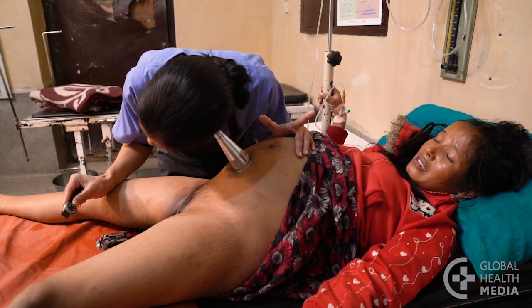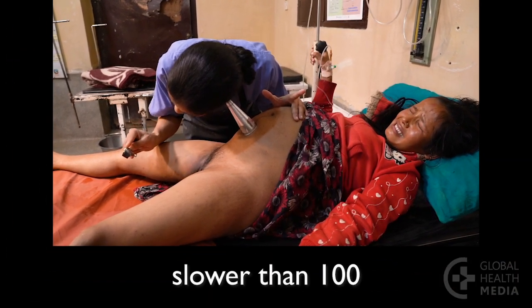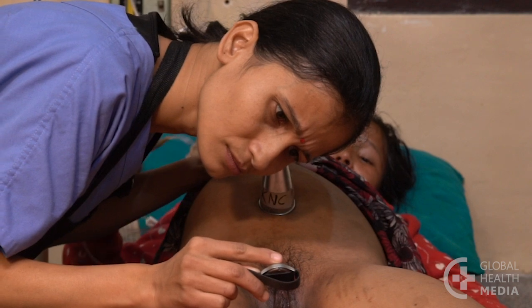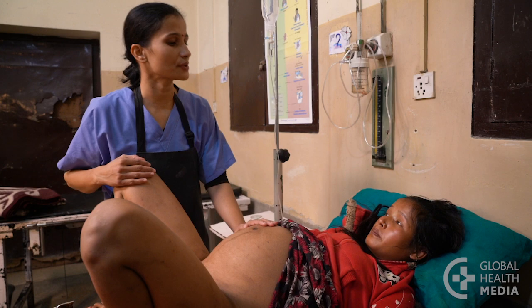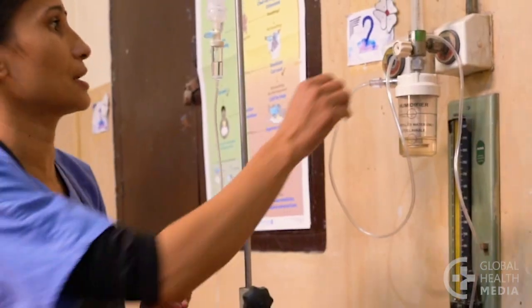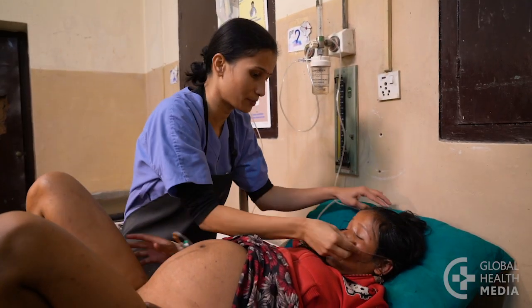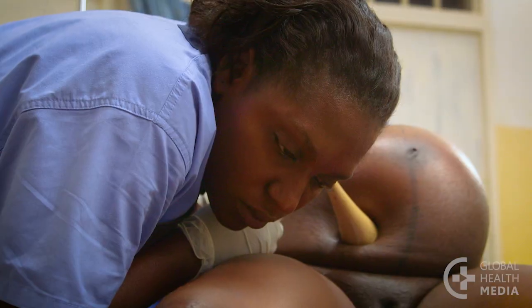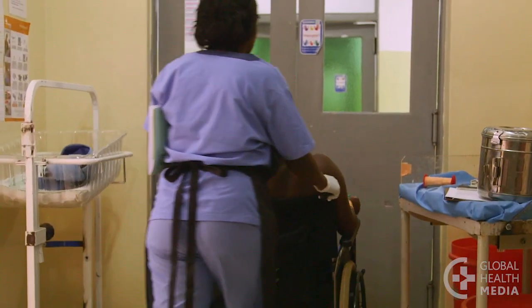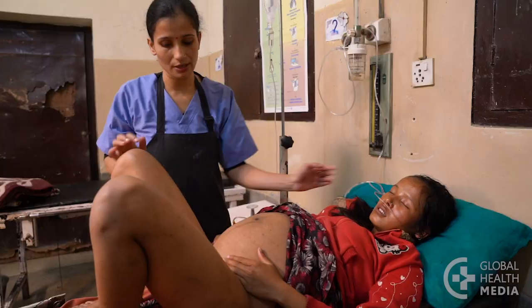If the heart rate remains abnormal for 10 minutes or longer, or the baby's heartbeat drops below 100 during a contraction and remains low for 1 minute after the contraction, you should make a plan to help the baby. Ask the woman to take deep breaths in between contractions, and if possible, give her oxygen. Talk with her about your findings and address her concerns. If she is not close to giving birth, transfer her right away to a higher-level facility where she can have a cesarean operation. If the woman is close to giving birth, get the baby out as soon as possible.